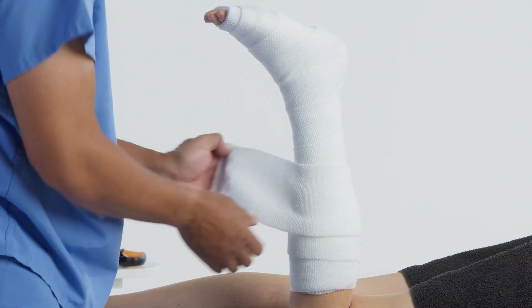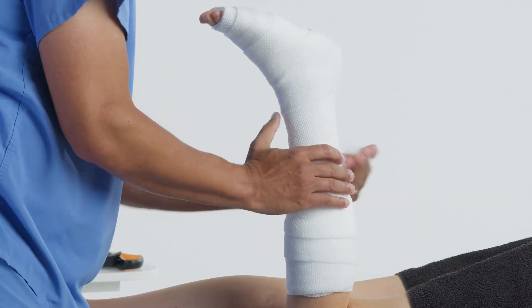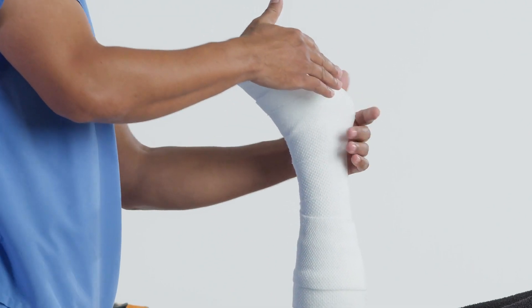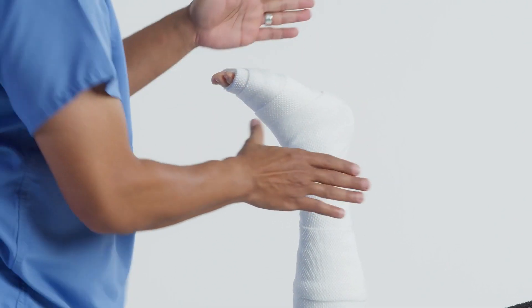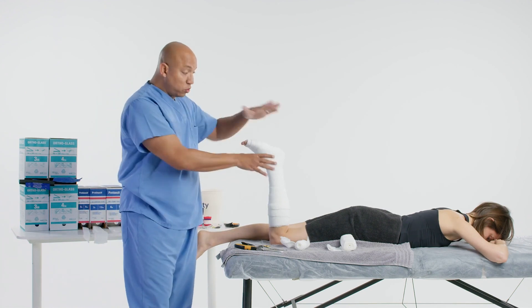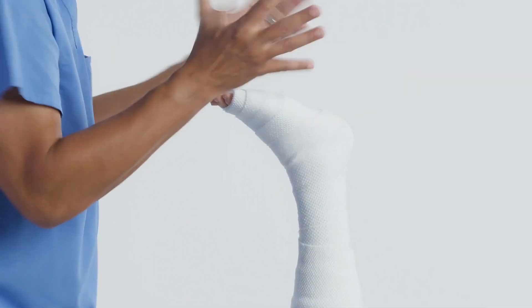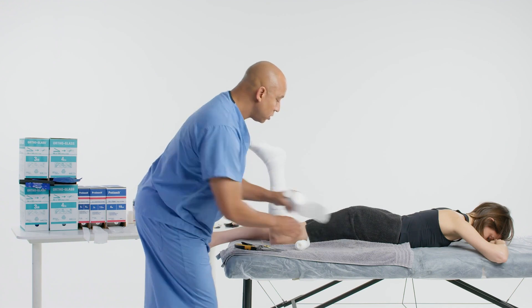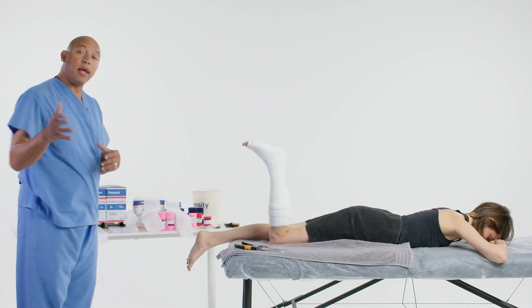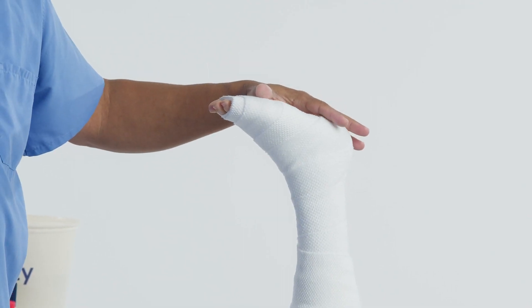You want to have at least a minimum of two layers, a max of four. You also want the padding to extend at least a quarter inch past where the splint will go. After you get done padding the patient, we're going to palpate over the bony prominences just to ensure that we have it padded correctly. Gently touch that on the patient because they're going to be very uncomfortable. I like to show the patient on the uninjured extremity what we're going to do so they can be ready.